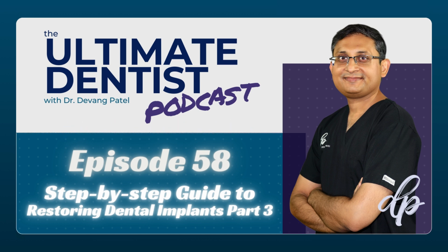So let's look at crowns. There are two fundamental differences between implant restorations. You can have a screw retained implant restoration, or you can have a cement retained implant restoration. Screw retained implant restorations we can break down into two different categories as well: screw mentable and UCLA screw retained implant restorations. So let's discuss these categories.